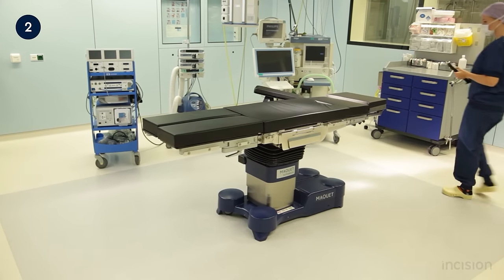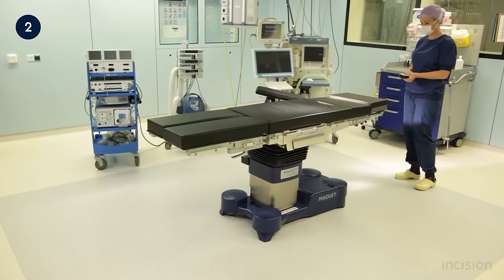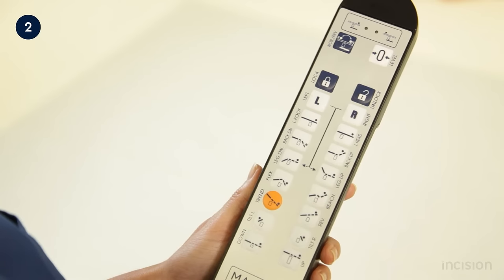Adjustment of the table is via remote control. The remote control should also be plugged into the main socket and charged when not in use. Note that not all controllers are wireless, and those with wires will automatically charge when the table is charging. The remote control's interface uses words as well as pictograms to identify the function of each button.